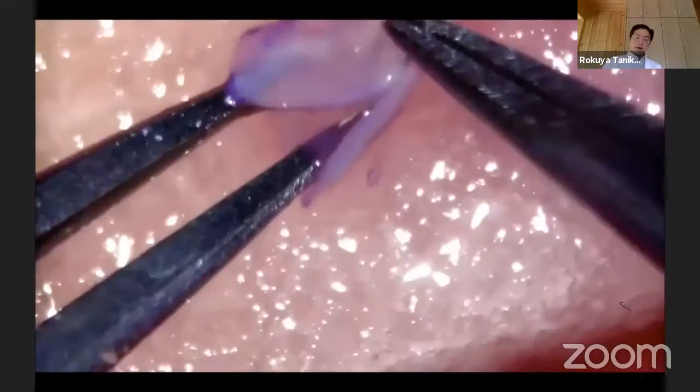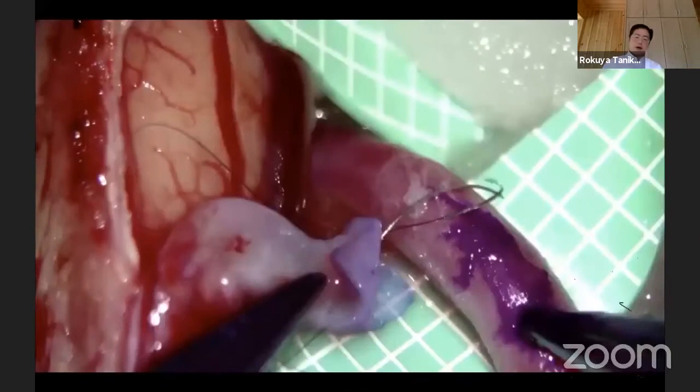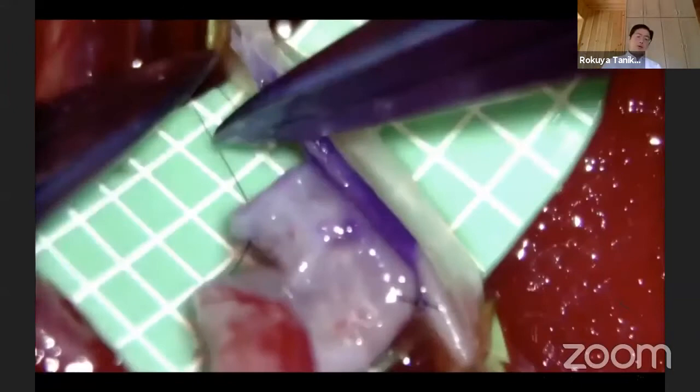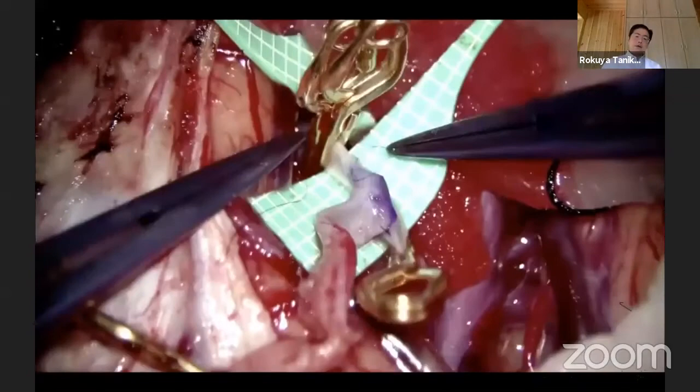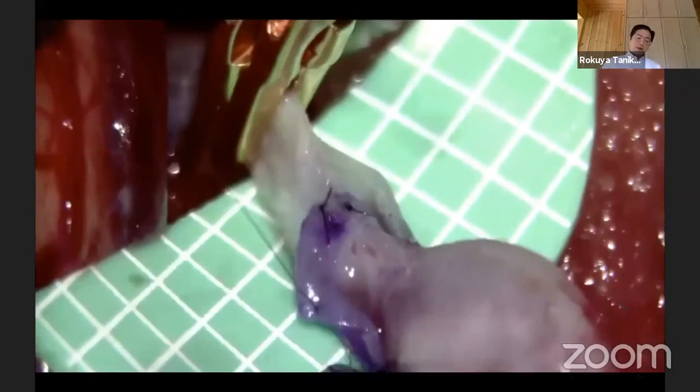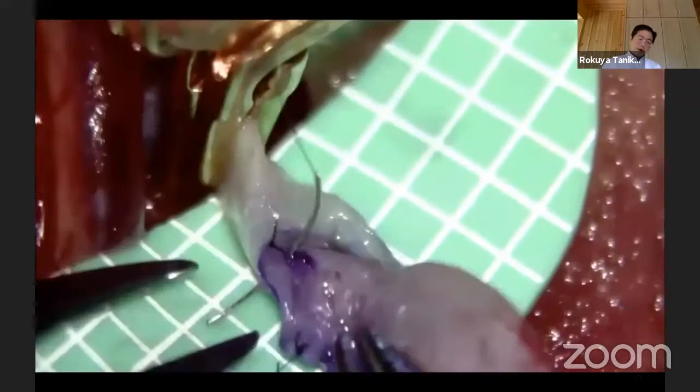The M2 segment is exposed for radial artery anastomosis. One of the STA branches is anastomosed to the M3 segment — the M2-side anastomosis with fish-mouth trimming on the STA. With the highest magnification you can confirm the exact penetration point of the 10-0 suture.